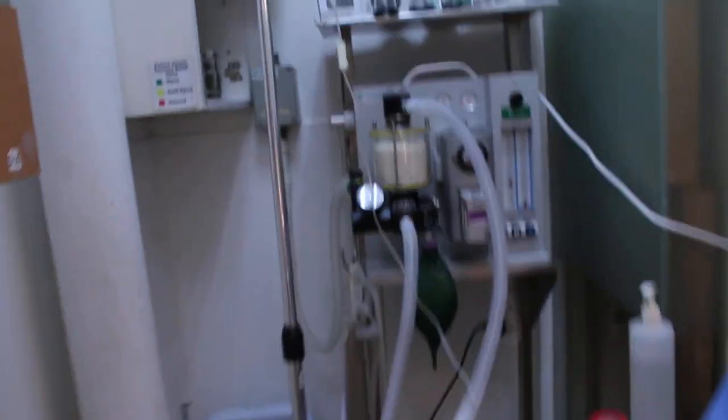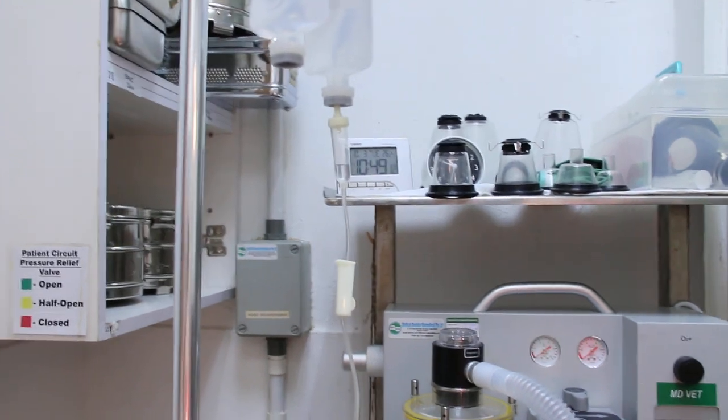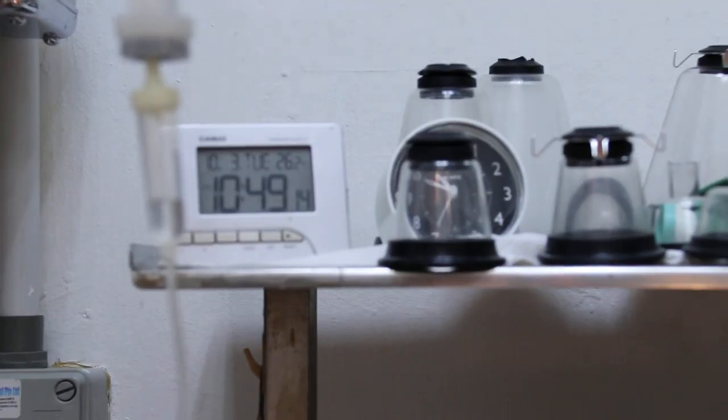Unless it's a big tub here. So they start already. So get ready to drip. Wait, you hold first. We can get the gas first.